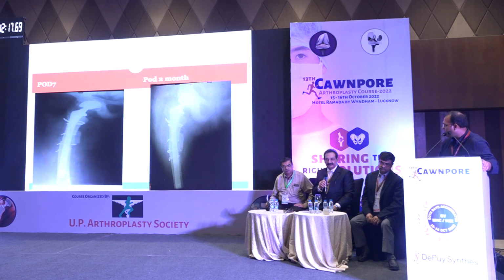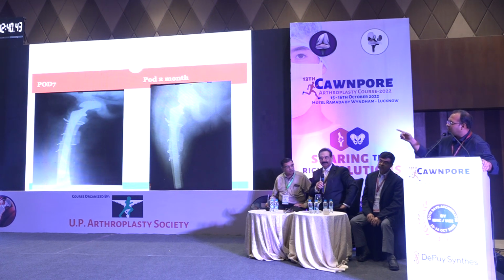I need the help of faculty. What could have been better to avoid this varus? I tried putting it in the center, but again it would take that path. You tried this SS wire near this fragment, tried to hold it, but the fragment was not held. This was a second fracture, when the stem was already in place, so it was difficult for me to go around and do it, and this wire slipped down intraoperatively.